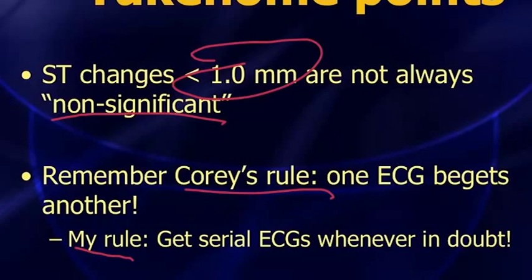AVR usually gets no respect. I've oftentimes referred to AVR as the Rodney Dangerfield lead because it gets no respect, paying homage to the famous comedian Rodney Dangerfield, who used to always say that he gets no respect.